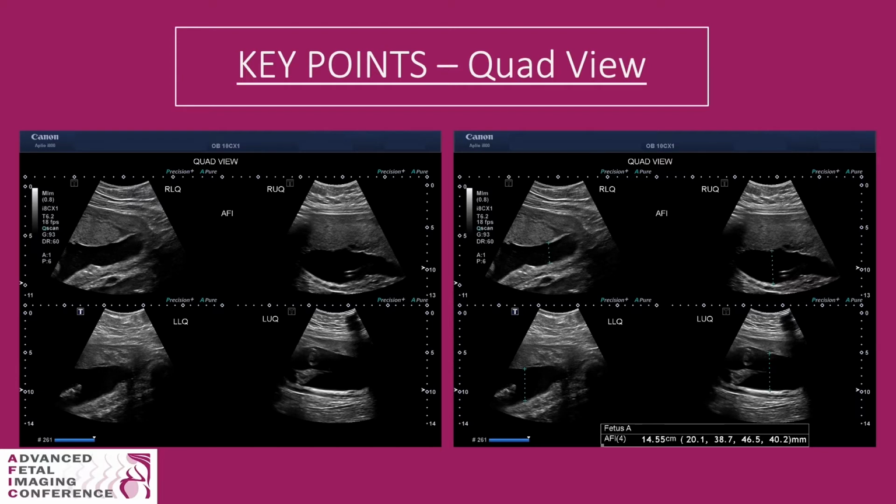If we as a group can standardize using quad view for obtaining AFIs, meaning every sonographer and every physician here today, I believe we will see a significant decrease in the errors made and reported related to amniotic fluid.